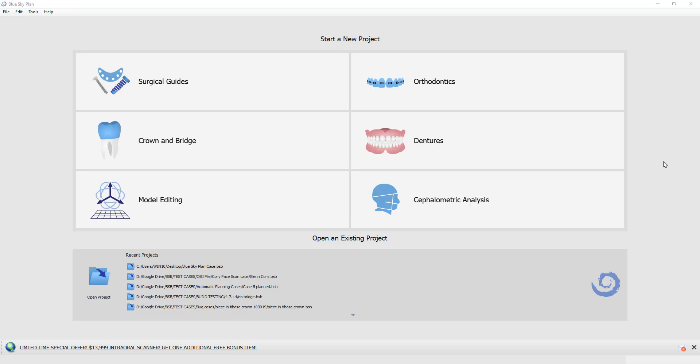This is Michael Saltzman from Blue Sky Bio and we're going to demonstrate how to create a bridge in version 4.7 of the Blue Sky Plan software.